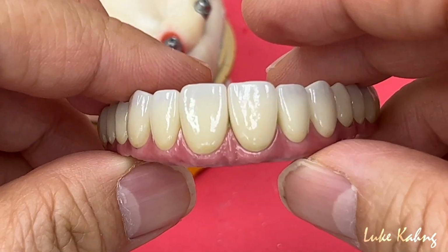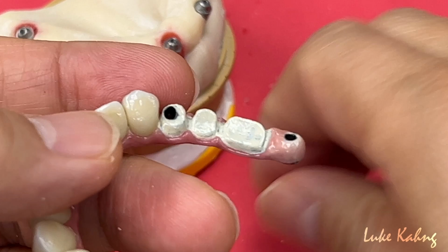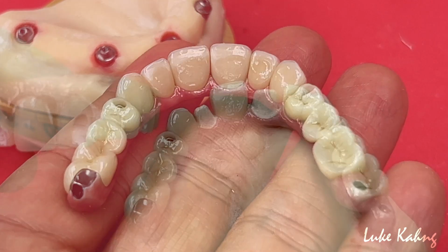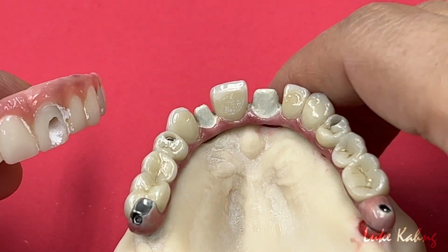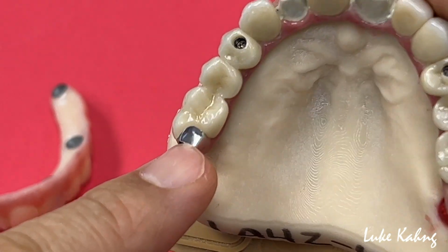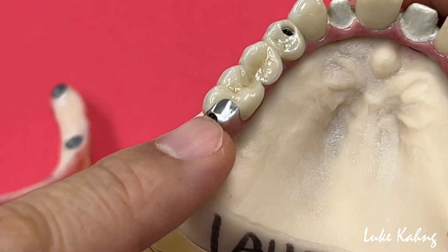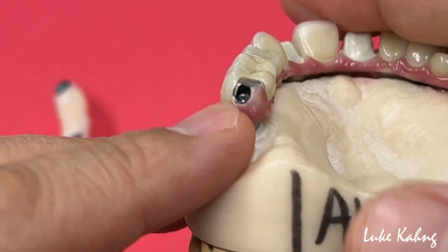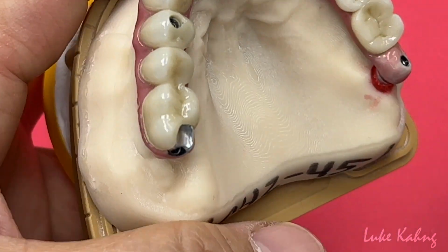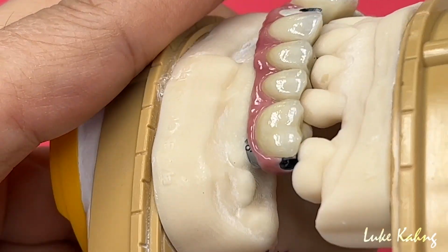So now we're going to cement. And then we'll get one piece. This is the final after cementation from the PMMA. We made it exactly the same as the design made in the metal lingual. So I'm trying to protect the implant height. So we're opposing, touching the metal, which is centric. More doctor compliant, a little bit.